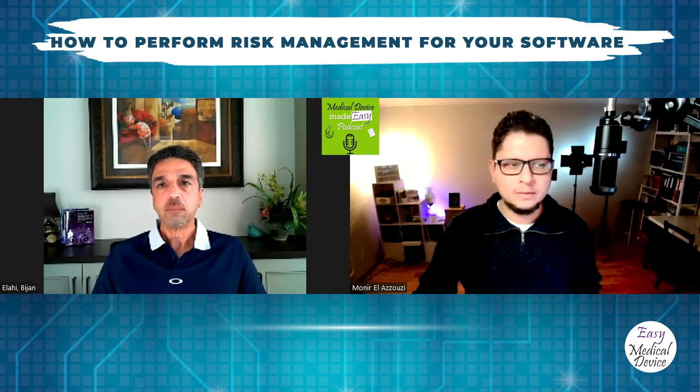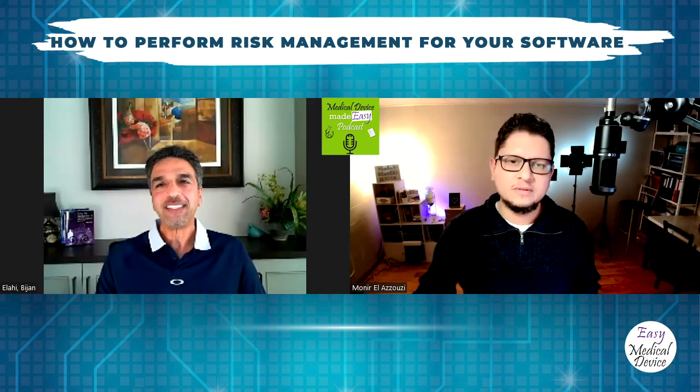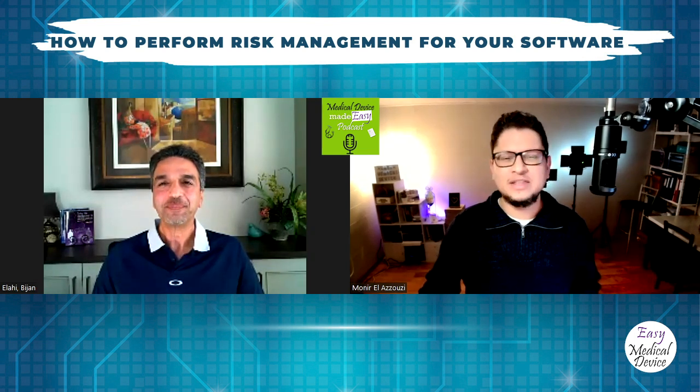Yeah. And by the way, because we're talking about software, let's not forget about IEC 62304. Exactly. And this one, plus, as we said, IEC 62366 for usability. So there are really a bunch of global standards that should also be used. There are some standards that are really software specific, and this is mainly something to look at.